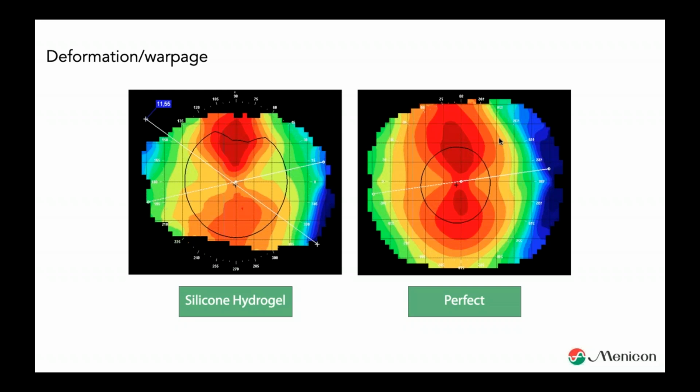If you look at the right side, this is a perfect example of a kind of measurement you like. Just perfect, beautifully curved shapes. And if you compare that to the left one, it is very irregular. With these kinds of things, we can get a better understanding of how the patient's eye looks when they enter our practice. And before we fit lenses, we can do so much more already before we even place a lens on an eye. That's what I want to cover in this topic.